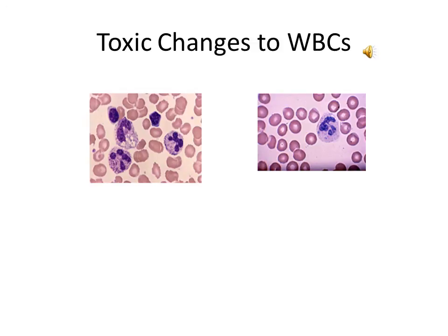Over to the right, you can see 2 Döhle bodies. There's 2 blue dots in there. Those are also a result of infections. Döhle bodies are oval blue, single or multiple inclusions originating in RNA. They can be seen in patients with severe infections, in patients with severe burns, in pregnant women, and in patients receiving cytotoxic drugs.